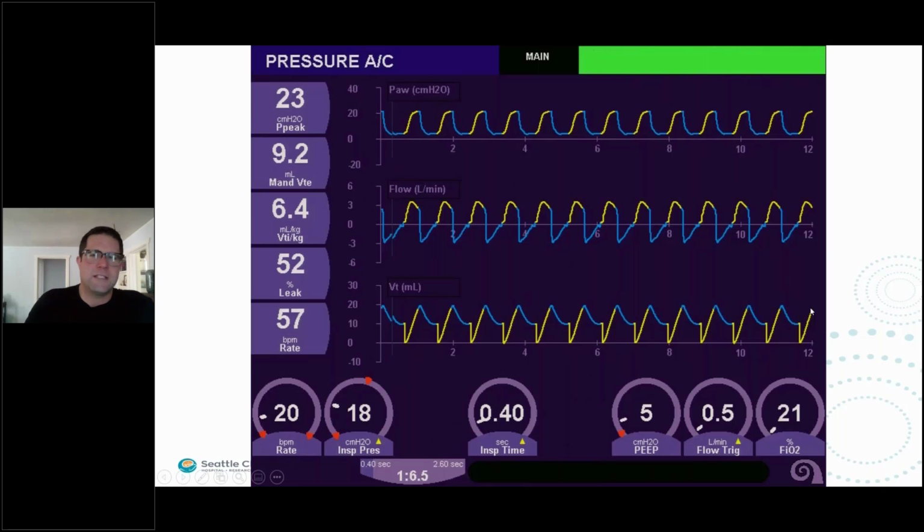And so whether you realize it or not, this poor ventilator interaction is a major problem for patients on the ventilator that we ourselves can basically try to eliminate or avoid. In patients who have very leaky endotracheal tubes, which there are many, obviously, they outgrow their tubes. Depending on the ventilator you're using, you should have good control over the triggering based on the leak detection and the triggering algorithm that you're applying with your system.